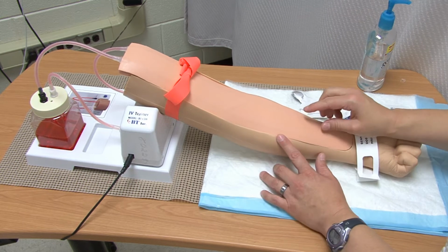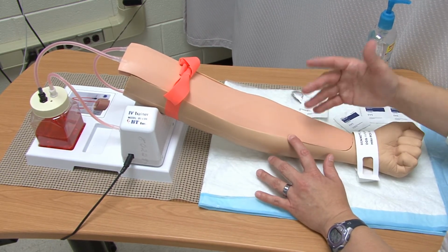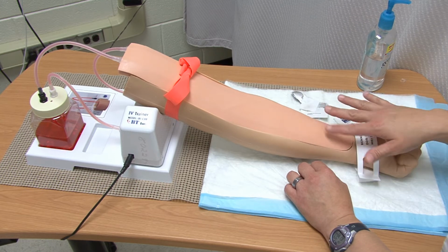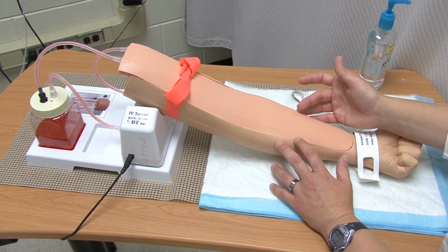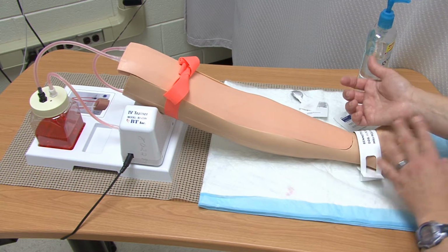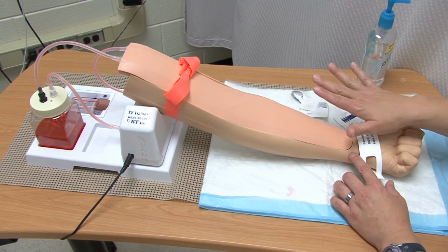As I'm assessing, we already said that you want to stay away from any area where your patient has had a mastectomy or if they have a shunt or a graft. Also, if your patient has any sores on their arm, moles, or abrasions, you'd want to stay away from any of those areas, and potentially the bends. Assess the patient's preference. This area here at the wrist is usually a little painful, so I tend to stay away from that.